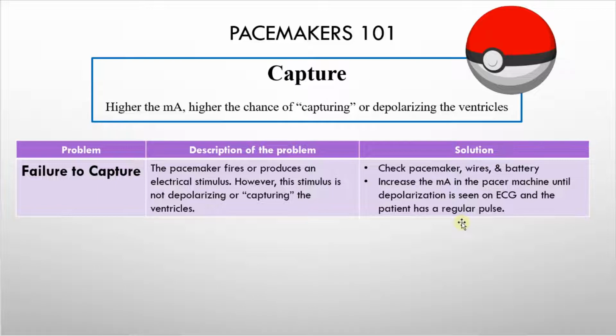So the solution would be to check your pacemaker, the wires, and the battery. And because the ventricles or the atria or both are not depolarizing after the pacemaker goes on, maybe the milliamps is not enough. So the solution would be to try to increase the milliamps until we see capture in our ECG.